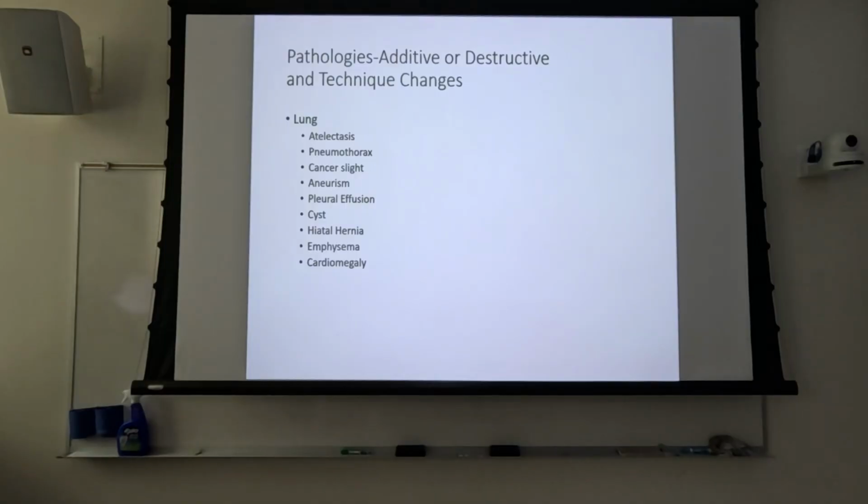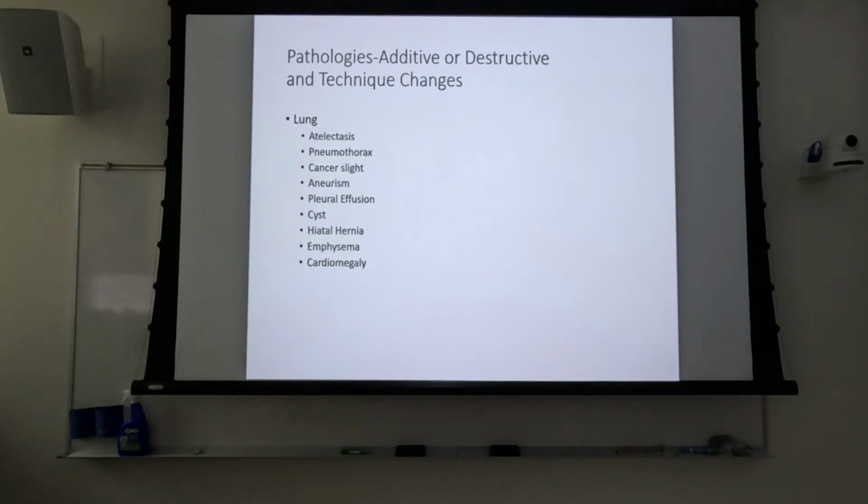It's going to be a lateral L-spine. An indication the patient has an aneurysm in that case would be presence of calcium just anterior to the vertebral column. Really don't need a change in technique for that either, because we have soft tissue on soft tissue, and then we've got little bitty calcium flakes that really aren't going to change a whole lot in the appearance on the image. You're just going to see them.